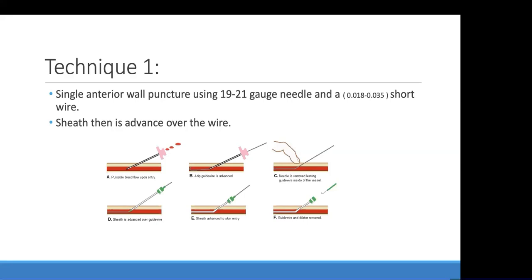They put their thumb and index, and then they puncture in between. I usually don't. I just puncture slowly, until you feel a pulse where the bevel is facing the artery, facing the patient. And then gently, once you puncture at 45 degrees, just change the angle a little bit, because you may be a little bit horizontal, to about 45 degrees, and then you slide the wire.